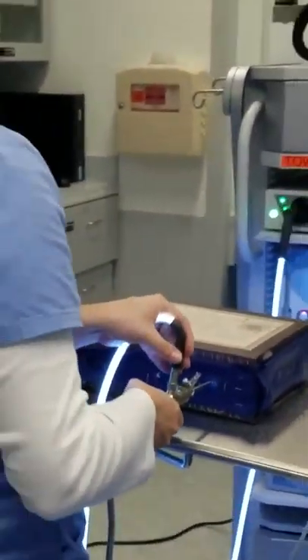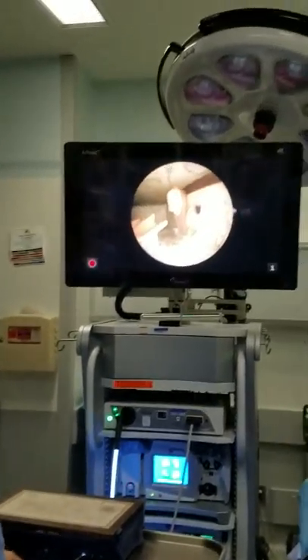On the back of the taxi cab. Okay. Find the, go into a different portal, go over here, this portal over here. I want you to find the meniscus. Hello? No. The meniscus, perfect. We'll find the bottom of the patella. The other side of the patella, I should say. Go right to it. Go all the way to it. Sorry.